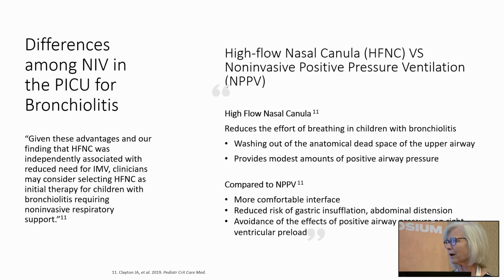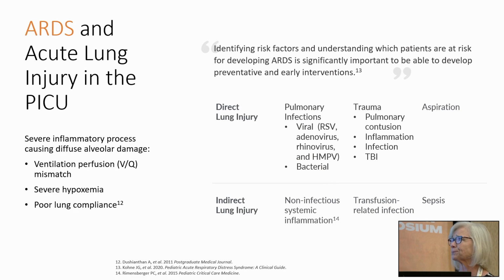There's also some vascular preload issues that you have when you're doing positive pressure ventilation. So because of this, mostly because of the comfort of high flow and that it's well tolerated, these kids didn't end up getting sick or intubated.